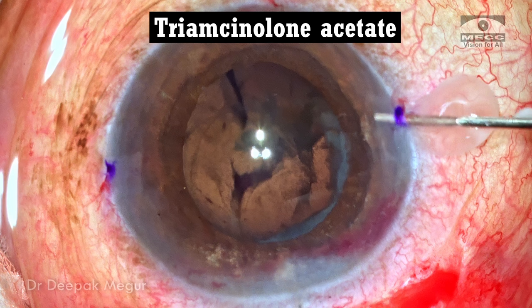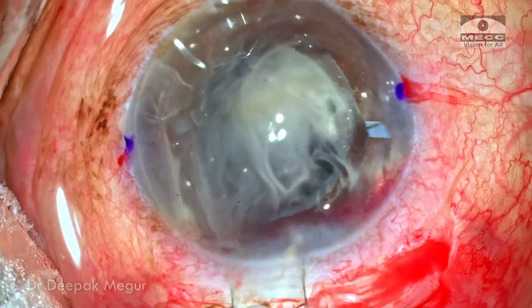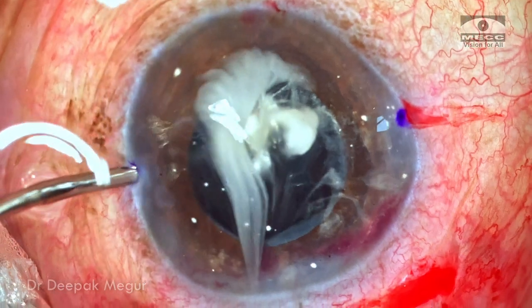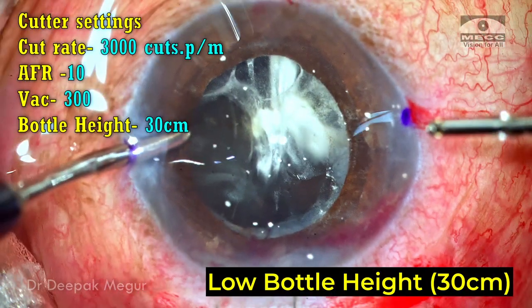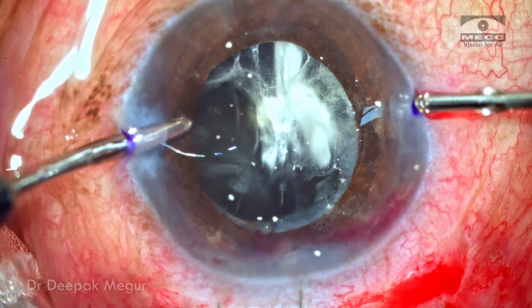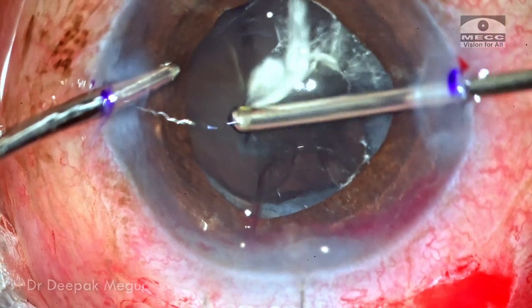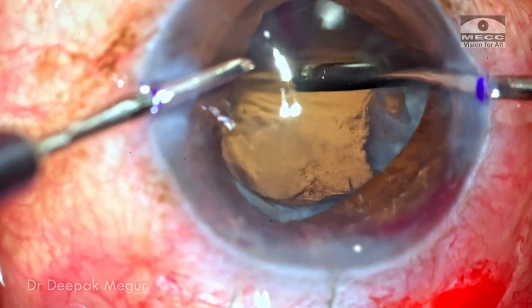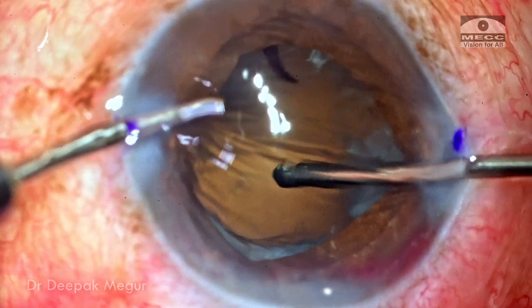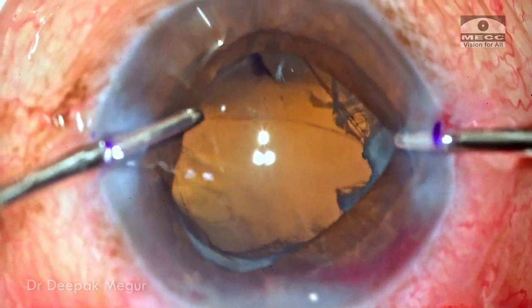The first step is to inject diluted triamcinolone acetonide to delineate the vitreous. Irrigation is introduced through my non-dominant hand using the other side port, with the bottle height set at 30 centimeters. With my right hand, I'm entering the anterior chamber with the cutter itself. In a few moments, the prolapsed vitreous in the anterior chamber is addressed by the vitrector. With the clearing of the vitreous and blood, visibility is now very clear and the posterior capsular tear and remnant are well delineated.